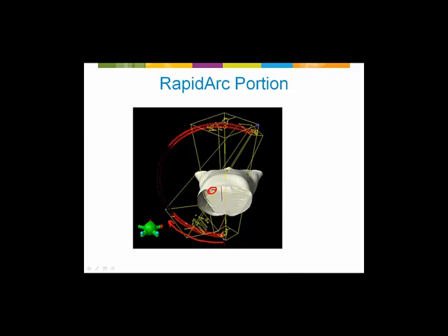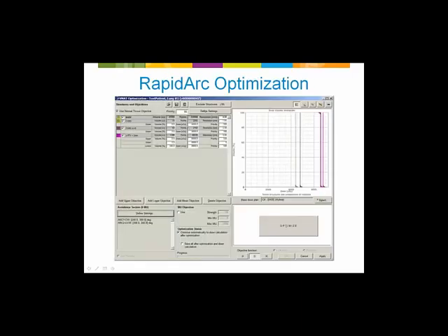And we don't need to put anything in the lung because the lung dose is very much determined by the geometry, right? What the beam sees, what the patient gets. So really it's the allowable gantry angles that have predefined V5 essentially. When we optimize the PTV, we add a little margin, and those of you that use Eclipse will know that this is a very helpful thing to help improve coverage around the edges of your target.